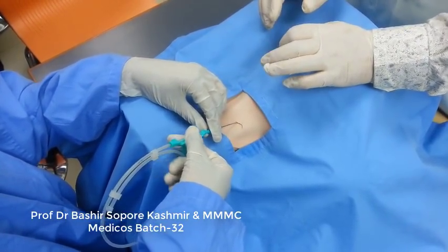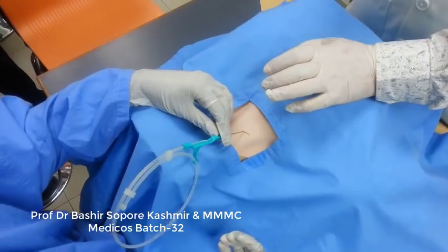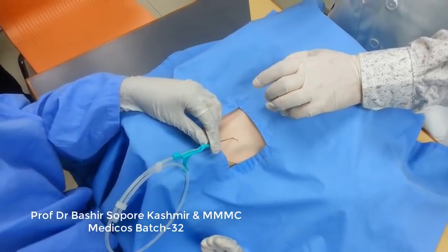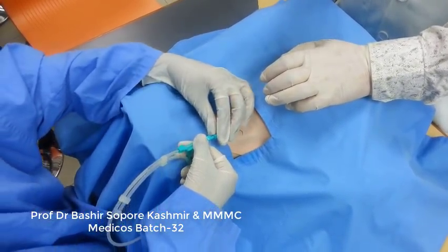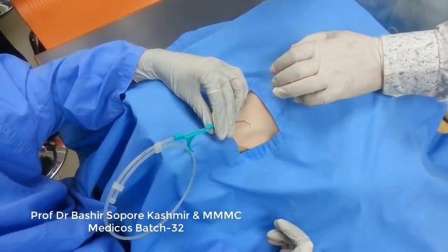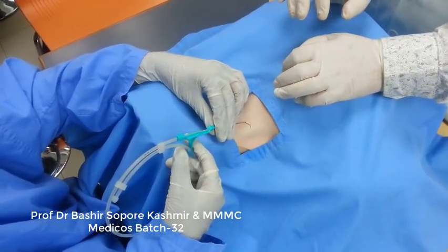So we have to advance up to 15 centimeters. But now I will explain. You see, if we push the guide wire more than 15 centimeters, that means we are going towards the right atrium. That means we are going to damage the right atrium, which is not needed. Our aim is that the catheter should remain in the internal jugular vein, just at the superior vena cava, above that. Do you understand my point?